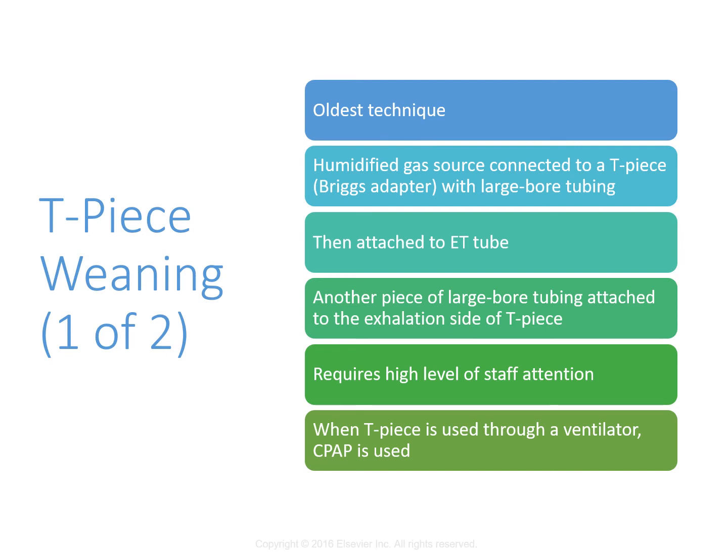So that would help maintain humidity, and if the patient inhales gas flow through the tubing from the humidifier side that's inadequate, from the inspiratory side that's inadequate, that might help keep the gas humidified that they're breathing in as well, right? And even their FiO2, so it could help keep their saturations up. So I was a big fan of this version of it, especially if we're able to get their peak flow or their total flow rate higher than what they could get through the ventilator circuit itself. And that was a limitation of the ventilators that I would use back in the day.